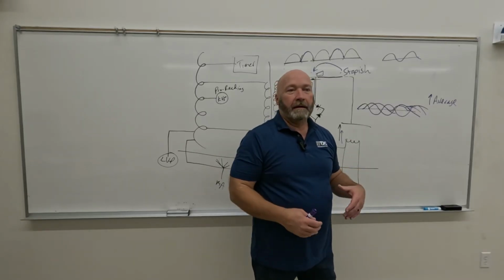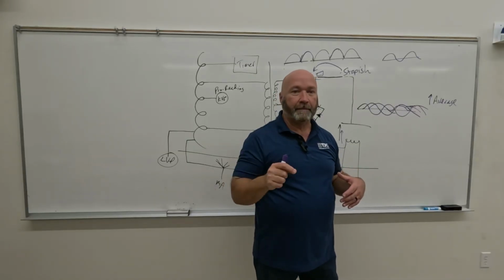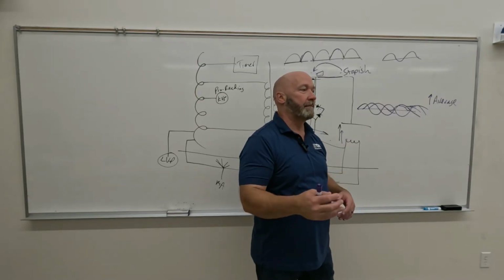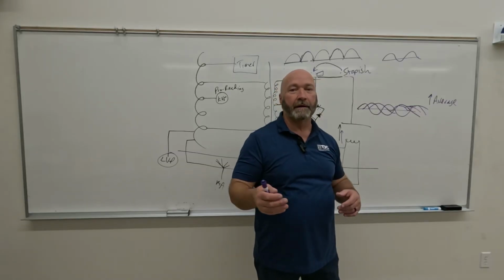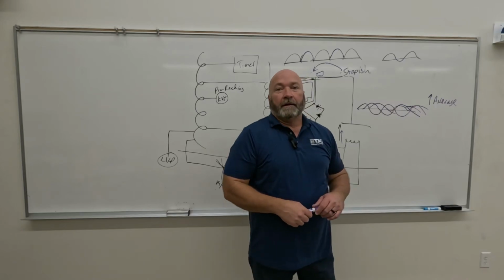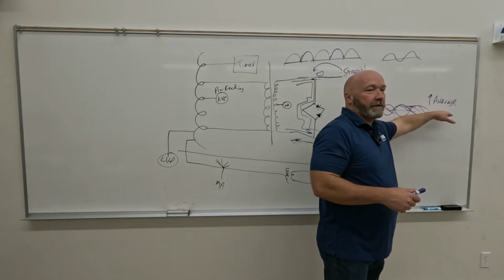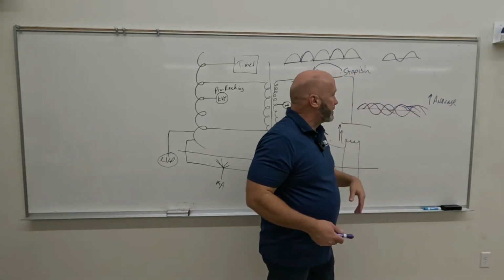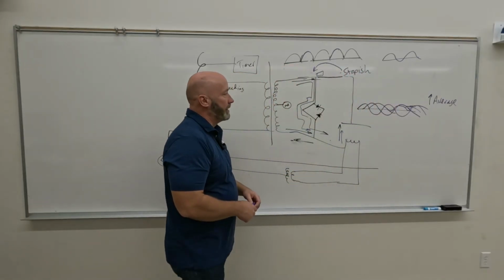The amount that comes out at peak power is actually very, very minuscule. Most of our X-rays have an average energy somewhere around 33%, or 1/3, of the peak energy. So anything that we can do to increase that average increases the quality of the X-ray beam, okay? So three-phase power increases that average, so it increases the output.